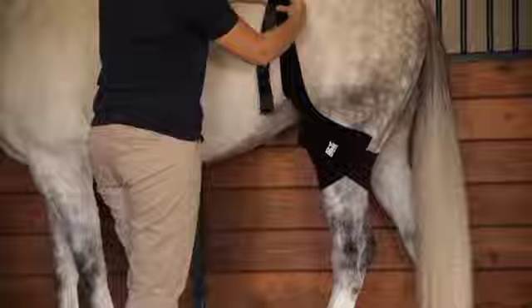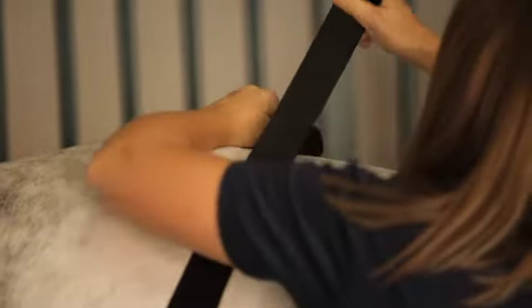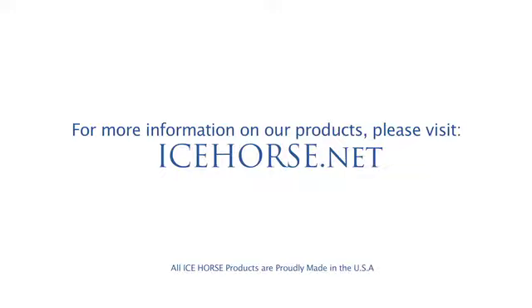Secure the velcro straps and place the suspender over the horse's rump. Repeat the process on the other stifle and fasten the suspender straps together. Icehorse, it's all about the ice.